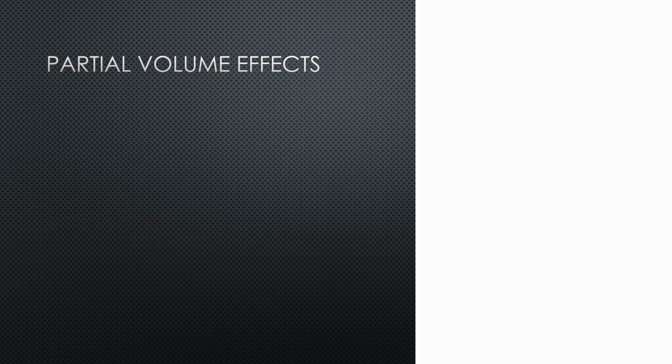While we're talking about spatial resolution, I want to come on to the final challenge we have with quantification, and that is partial volume effects and how we can overcome this using partial volume correction. So it's known that any structure with a diameter of less than 2.5 times the spatial resolution of our imaging system will be affected. So if we're looking at small features, the uptake we measure will be reduced. It won't be the true value. It'll be less than what it should be.